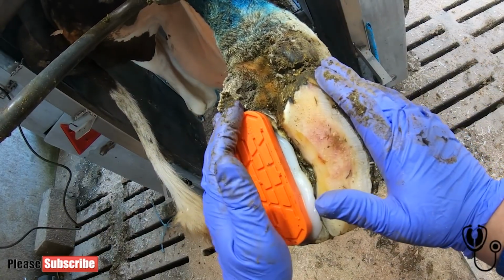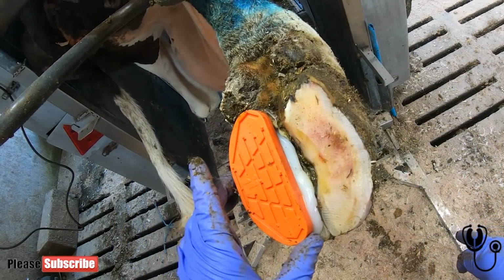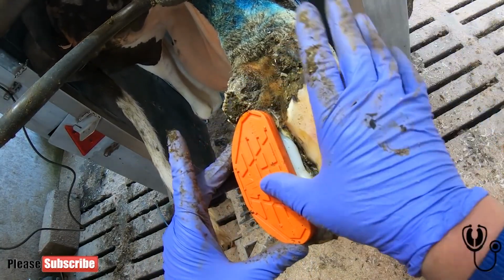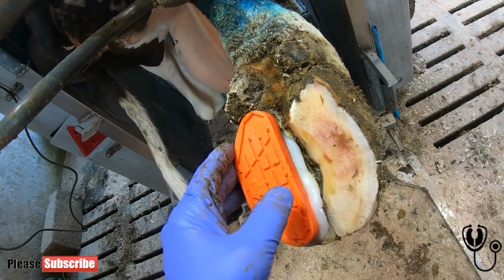So the block is going to lift this claw off the ground, and this claw should take 95 to 100% of the weight. We'll see when she walks out what it's like. But yeah, this will be removed in 2 weeks, or 3 weeks, 4 weeks, and this should have hardened up by then and should be good to go.